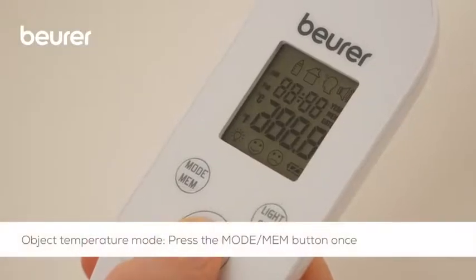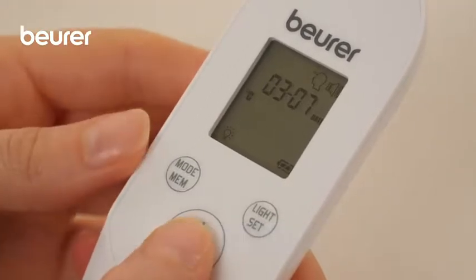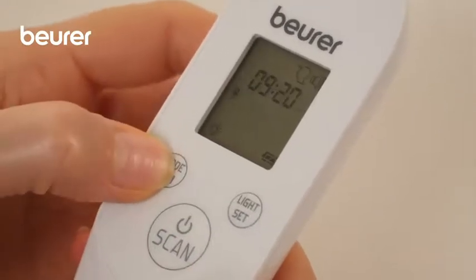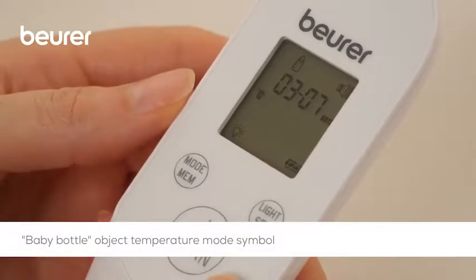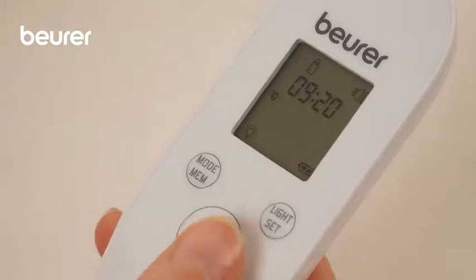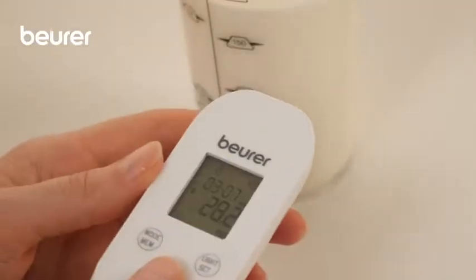If you want to measure an object temperature, switch to object temperature mode. With the thermometer switched on, briefly press the mode MEM button. The baby bottle symbol appears in the display. Hold the thermometer 2 to 3 cm in front of the object and briefly press the scan button, then read off the temperature in the display.